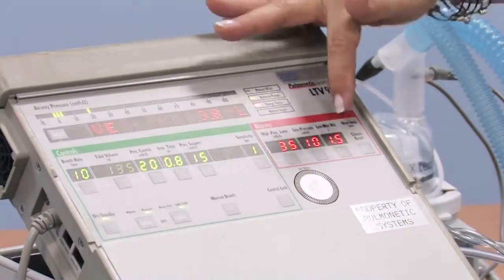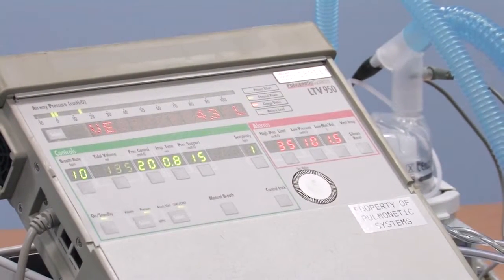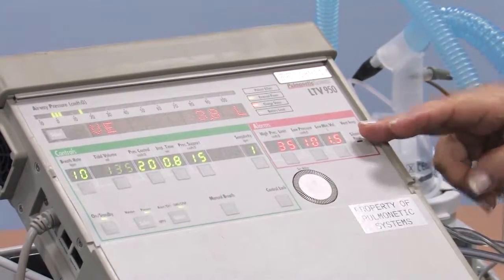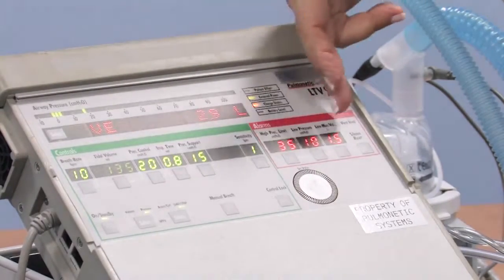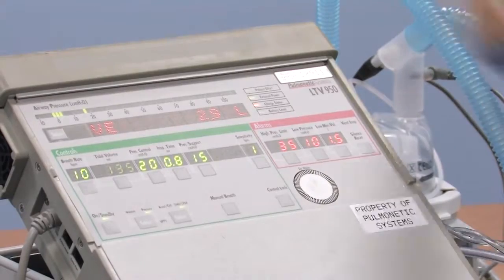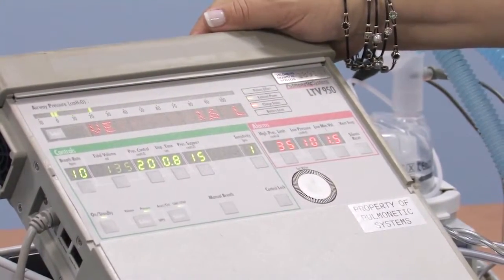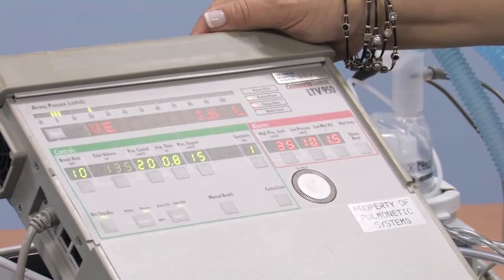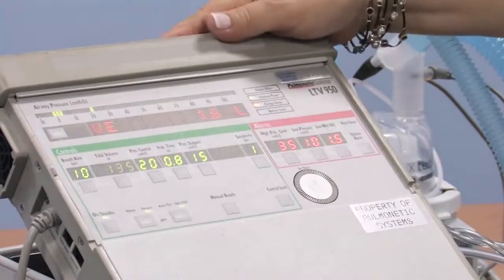So if this 3.8 drops below 1.5, because no air is getting delivered to them, or less air is being delivered to them, it's going to alarm. The closer you set this alarm to the measured amount, the sooner it goes off. But once this number drops below 1.5, it will alarm and it'll say low min volume. And you'll see that momentarily. I realize this is a difficult concept, and those that are training you will certainly go over this as many times as you need to.